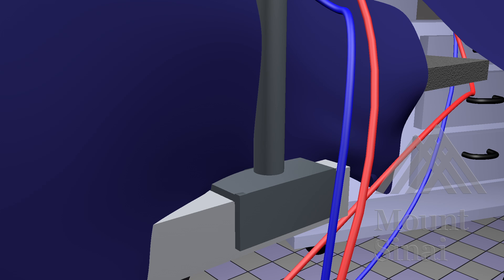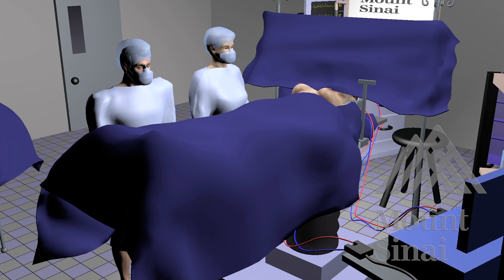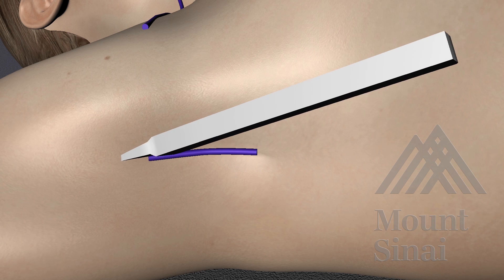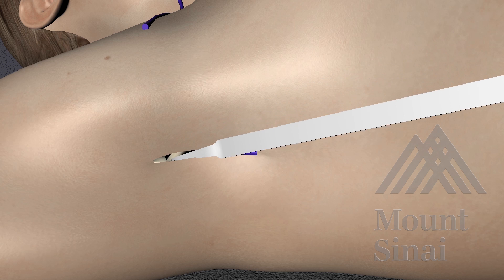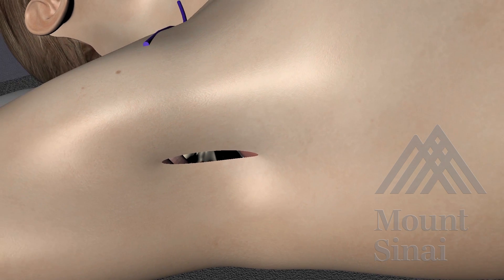Mount the retractor on the opposite side of the patient's incision. For a right-sided incision, we prefer this operating room setup with both the surgeon and assistant on the patient's right. First, make an incision approximately 5 centimeters long in the anterior axilla and begin to create the cutaneous pocket anterior to the pectoralis major muscle.